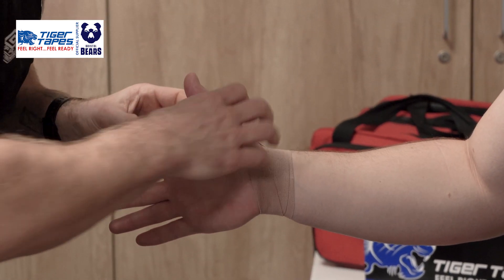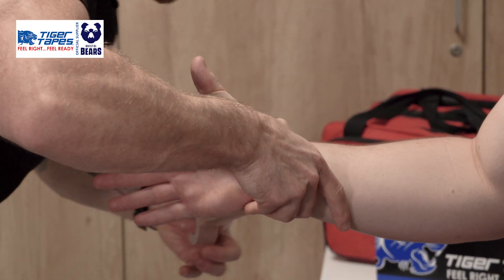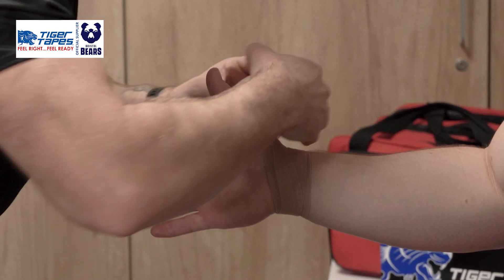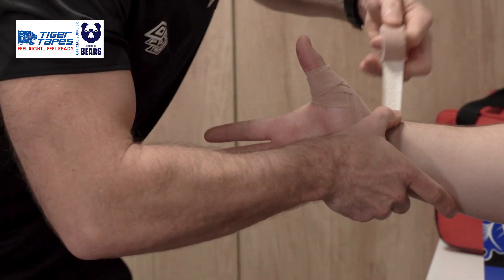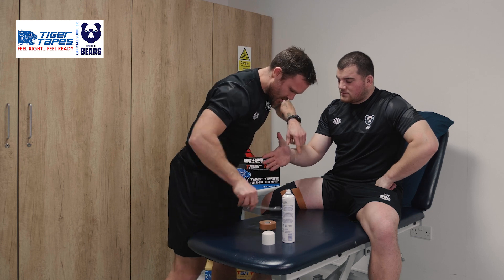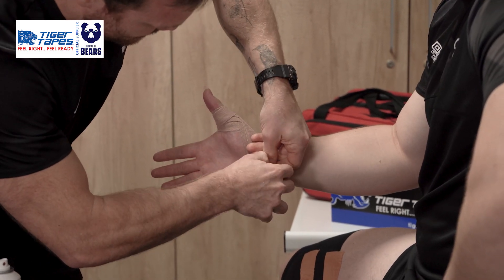One more, in that same fashion again, covering all those ligaments of the thumb. And then the final one up, and this time just around that top part of the thumb, making sure it's functional, looping back around to then lock off around the wrist. Scissors for the EAB, another piece of Tiger Tan Tape to lock that off.